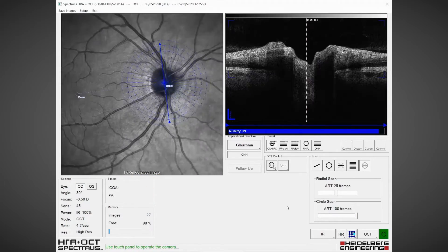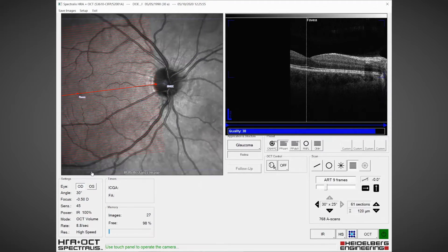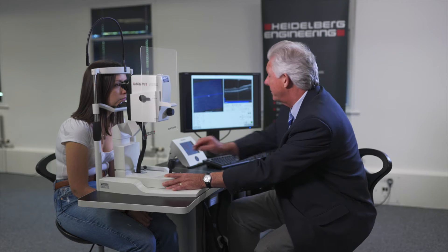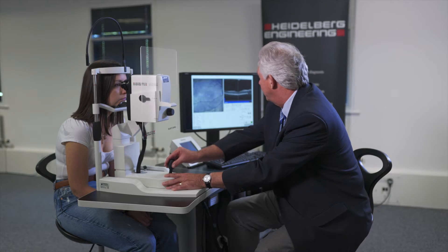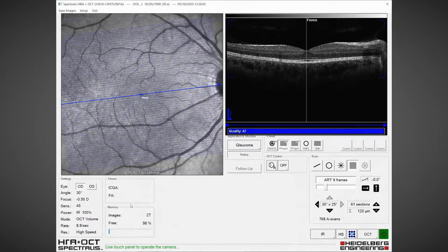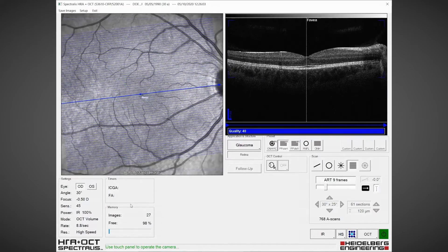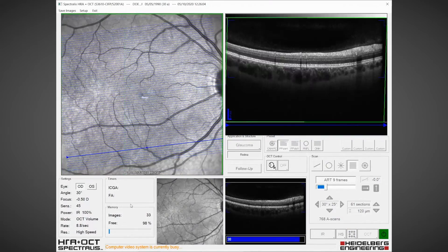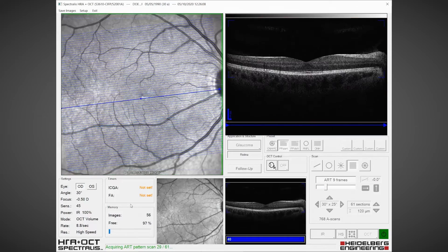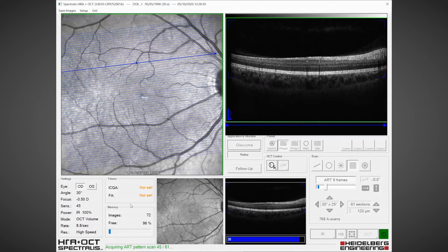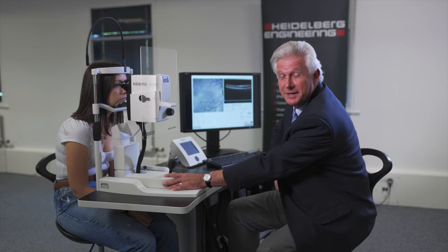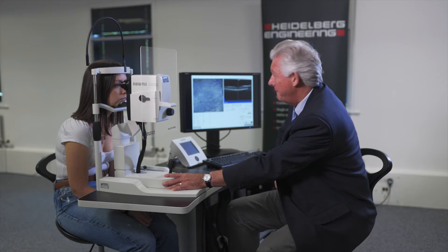We complete that, then we do the posterior pole scan to look at the whole macular area. I acquire the image with ART9 — an averaging of nine scans per B-scan — and then we can segment all of the layers and look at the ganglion cell layer.